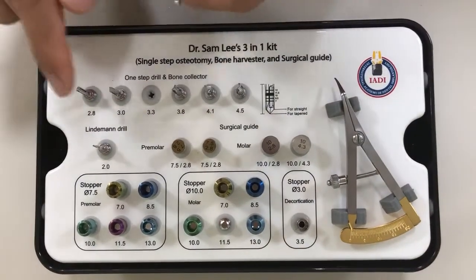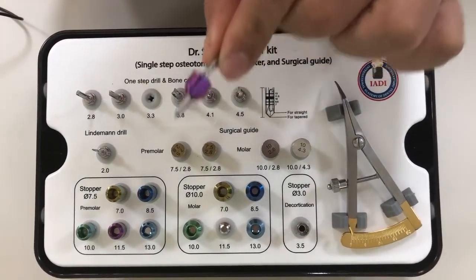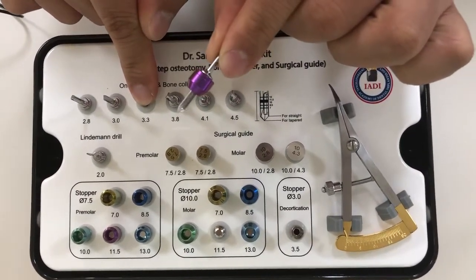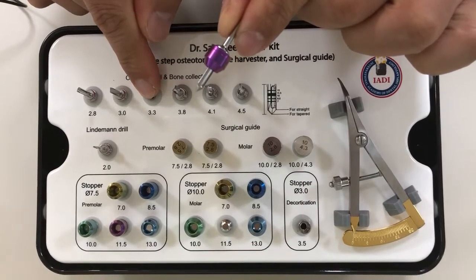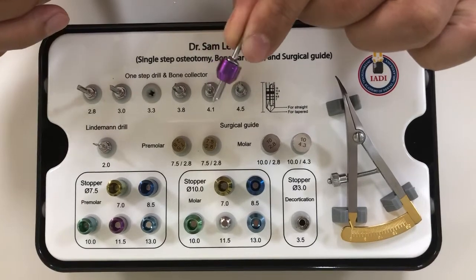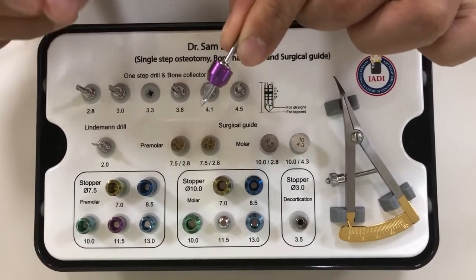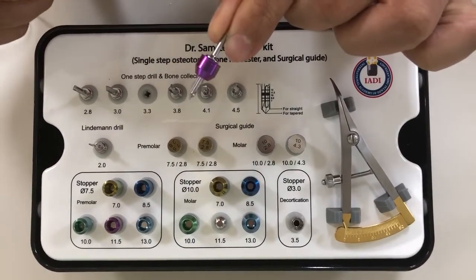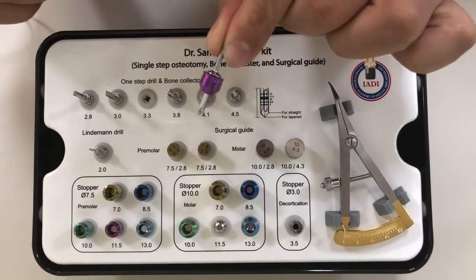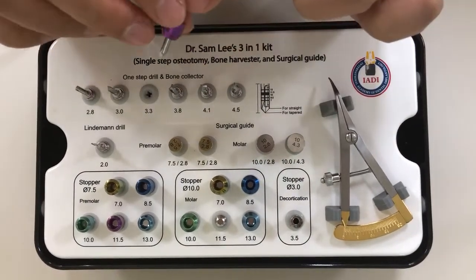A unique thing about this drill is that you don't have to do sequential osteotomy — you just jump right into 3.3 millimeter diameter and you'll be able to place a 4.0 implant. In the maxilla you could just place the implant, however in the mandibular ridge, because the bone is more cortical, you will need to use the final drill from your implant manufacturer, and then place the implant.